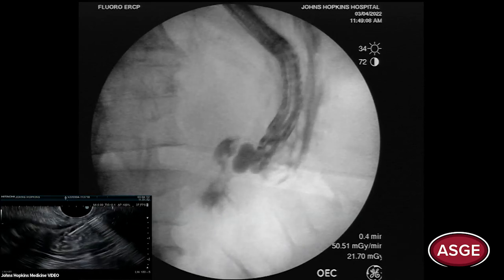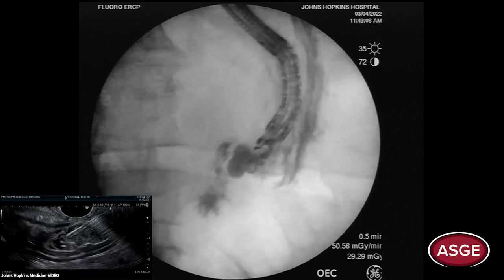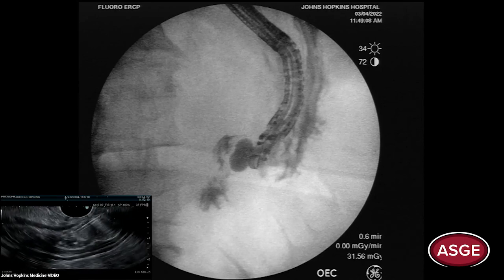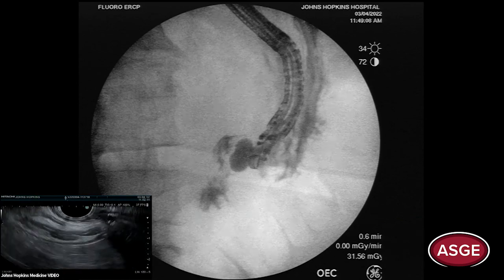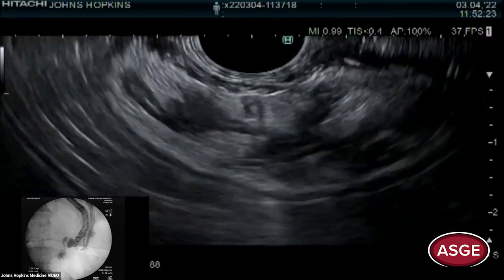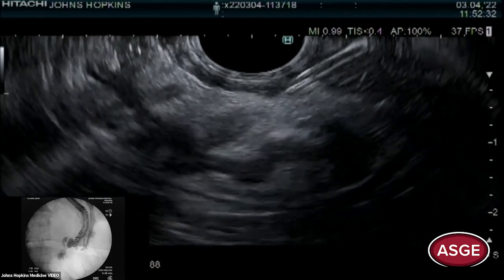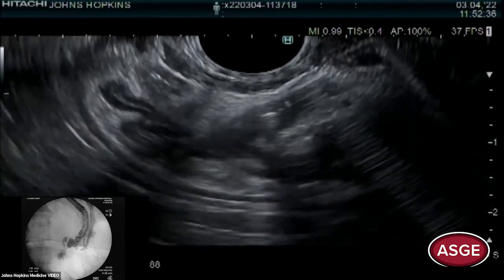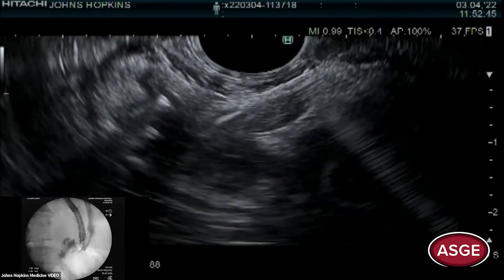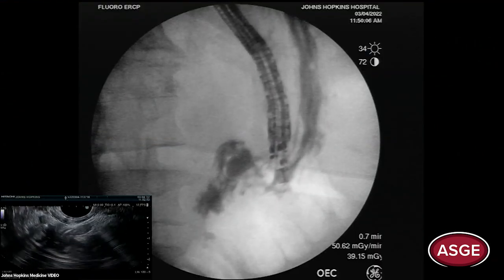You can see the vertical part of the proximal stomach to the right of the scope, which is what you want to see. We're attached to a pump. I'm pulling my needle back because part of this was intramural — we don't want to mess it up. The test injection: you want to see contrast going toward the fundus. I'm using a 19-gauge FNA needle. You can also put the Doppler on and you should see swirling if you're in the lumen, whereas intramurally you won't see a Doppler signal.